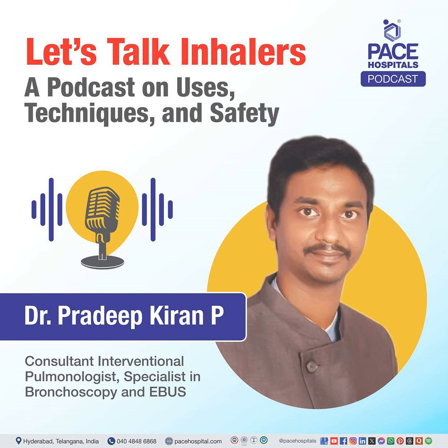To take a dry powder inhaler along with the capsule which contains a drug, you have to use a device. This is the device which is commonly available nowadays. Earlier it was Accuhaler which were used, but nowadays these are simplified versions. So now, how to use these DPI devices? Now, as you can see, there is a cap. There are two buttons which are marked by different colors.